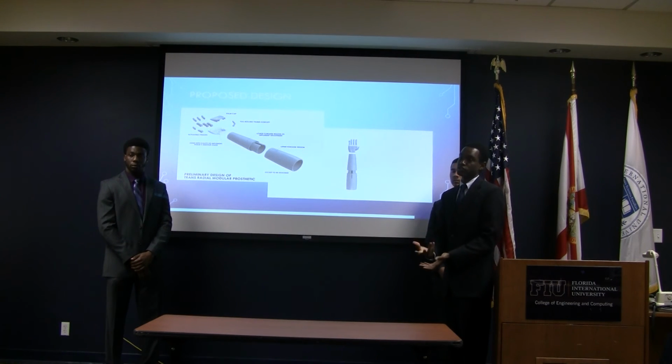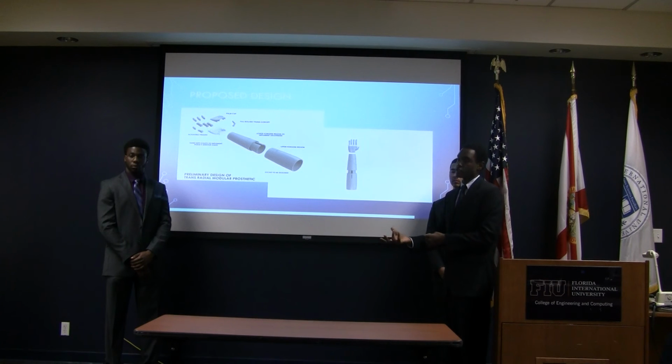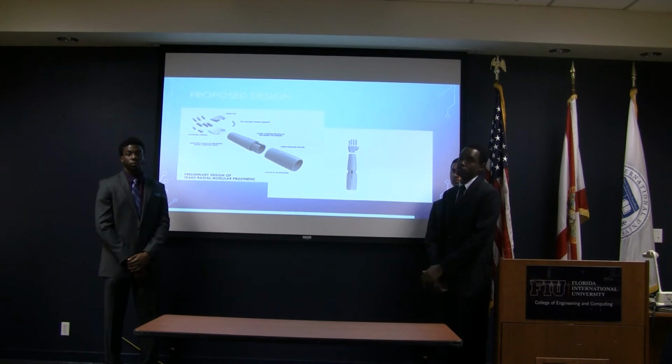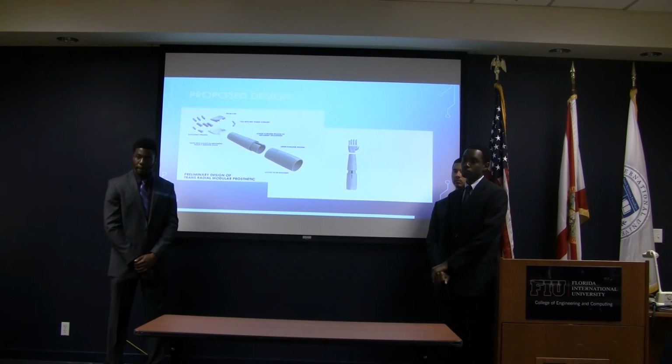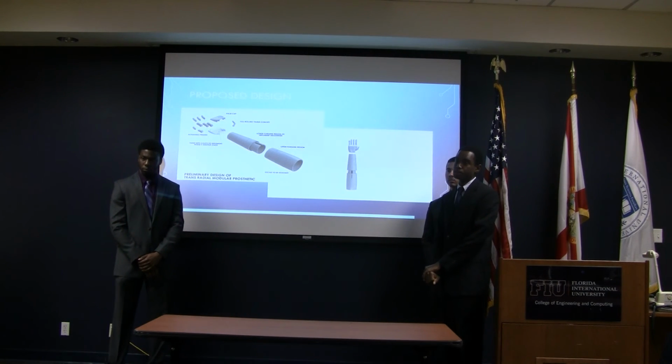So it'll be an electrical system, pretty much. An electrical system that takes impulses from the residual limb. We found open source circuitry to actually read pulses from the residual limb that we can use to translate signals to the DC motors. Okay, then, as the child grows up, you're going to take one of those sections and enlarge it so you can still use the hand? Yes.